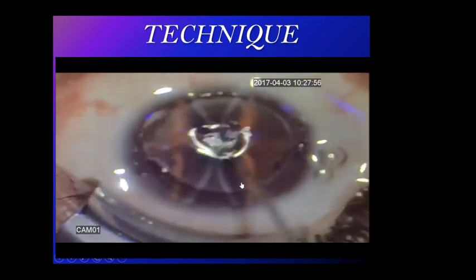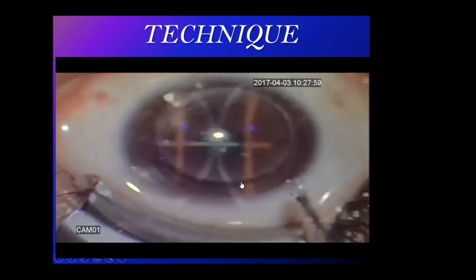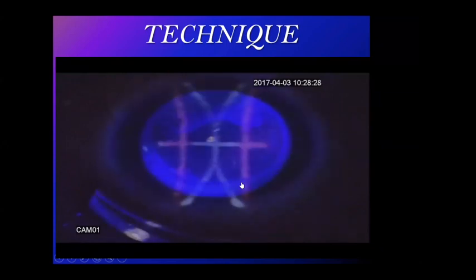Dr. Sami, when you do the first step, for example, how many microns? 50. Then you do irrigation and then another 50? No. The total is 50, 55, 60. That's it. So you do it in steps of 10? No, I don't take 10 by 10 or 15 by 15. I look at the black spot. Once it becomes irregular, I stop and I add fluid, because these are, as I said, the spikes. So it's not just going 10 by 10. You go, and once it is irregular, you know that you reached another spike, put another fluid and try to go down. Interesting.